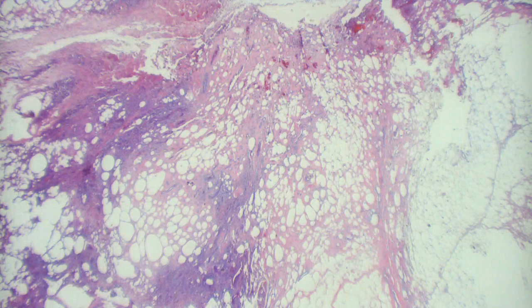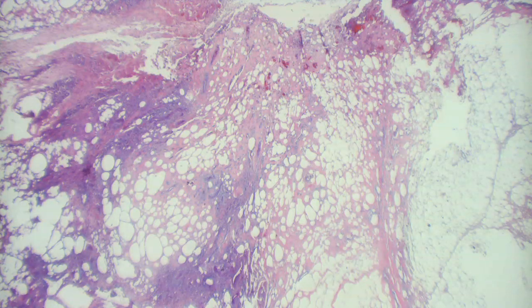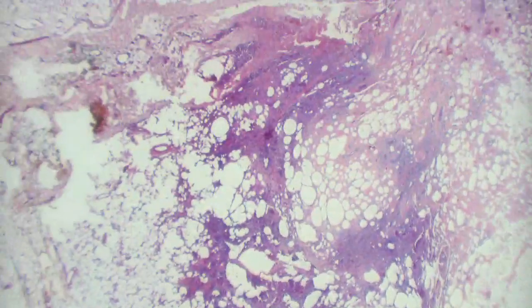It gives you all this necrosis, and the spider basically injects you with chemicals that cause all of this necrosis and degeneration. It causes vasculitis. Okay, and this thing probably was an open wound and may have gotten secondarily contaminated and infected. I don't know whatever happened to this patient. It'd be kind of interesting to find out.